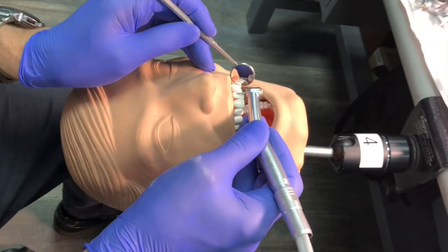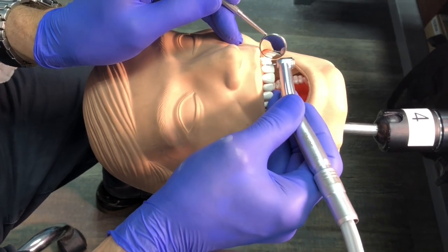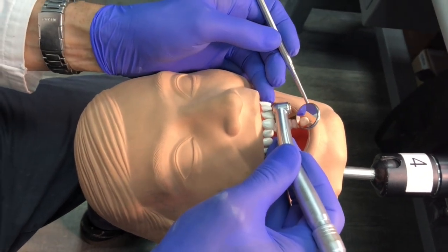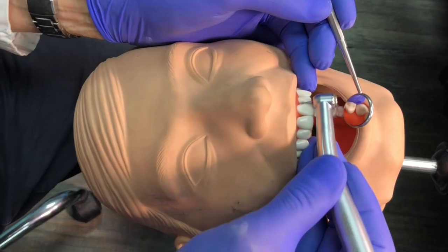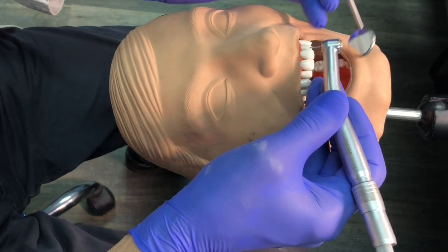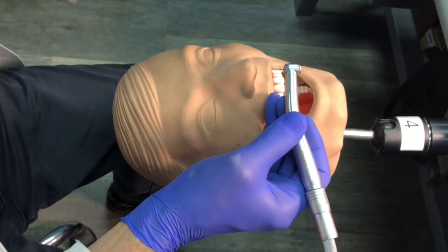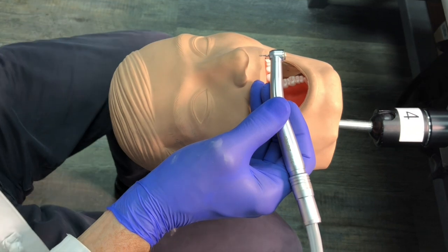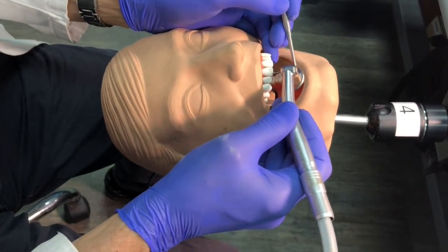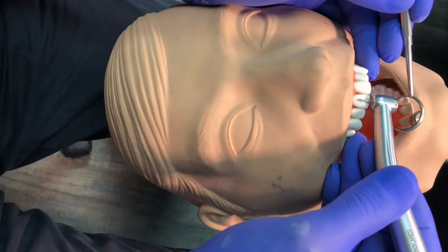We don't want the mirror off to the side while we're operating. The problem with that is left doesn't necessarily mean left in the mirror — distal doesn't mean distal and mesial doesn't mean mesial. When you line up the bur and move to the distal, that means distal in the mirror too, so what you see is what you get. To simplify your life, just have your handpiece, your mirror, and the tooth all in the same plane.